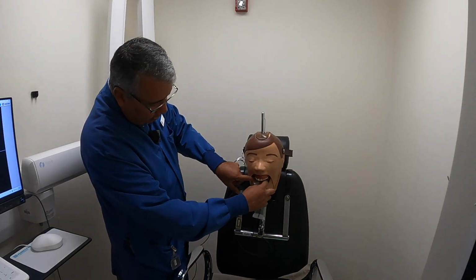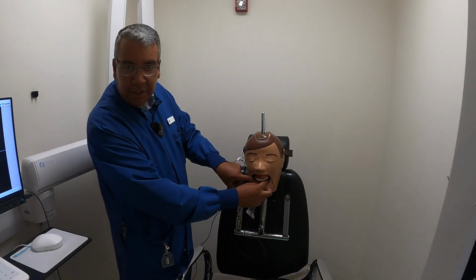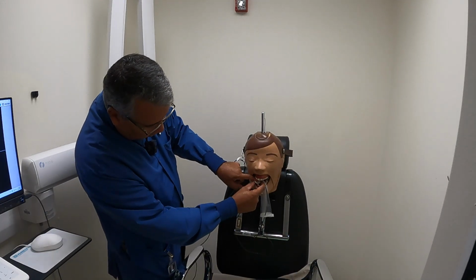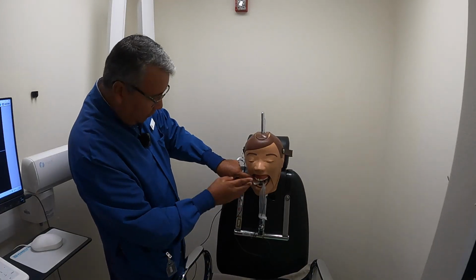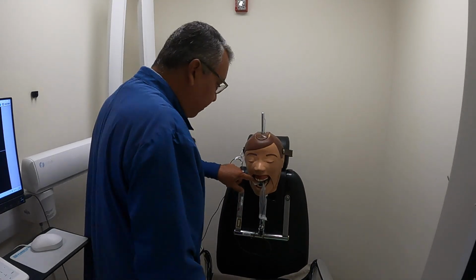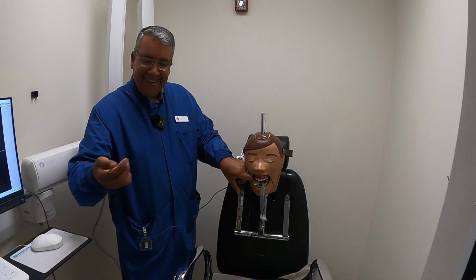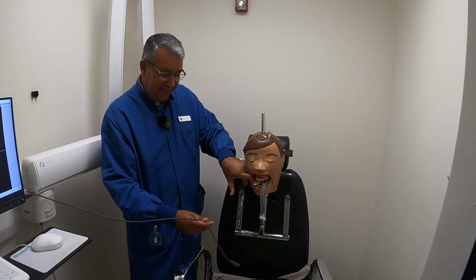Now, I'll tell you that this black sensor is a lot harder to see than your normal film. It just is. So you want to make sure that the side of this completely covers your canine. And from right here, notice I'm not standing in front of the patient, for so many reasons.